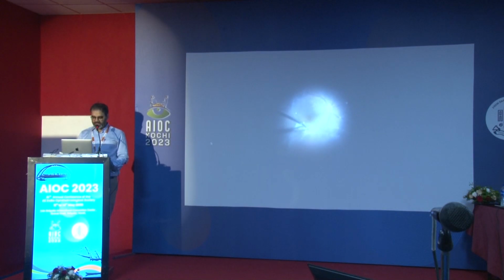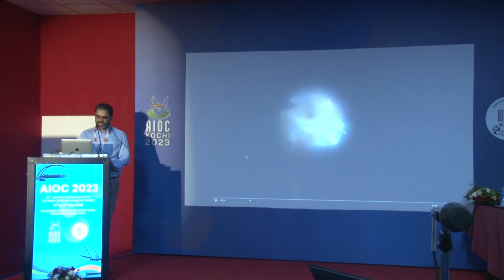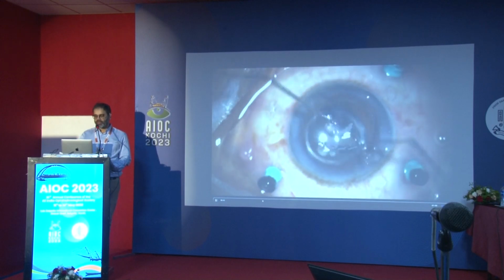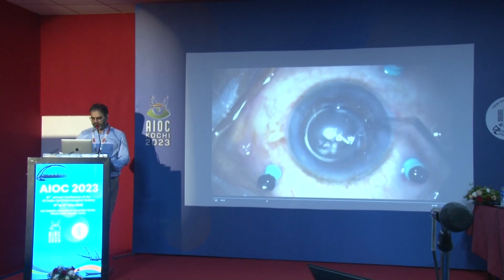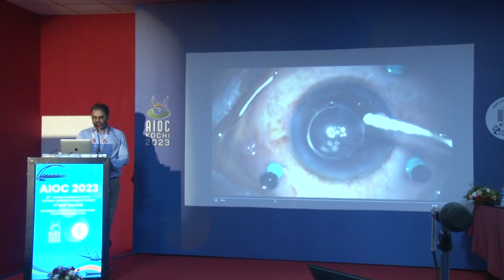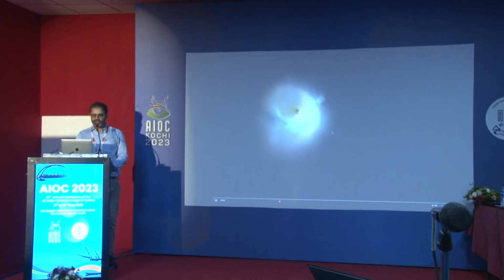Now this is another case where we had a retinal detachment with PVR changes, and we were removing the membranes over the retina under the oil. During this procedure, I had an iatrogenic large macular hole, which is not captured here. This patient's posterior capsule was also compromised, where you can see it's hardly there, and I had no other resort for closing the hole. It's not about the hole; I was more concerned about having a re-detachment because of the hole.